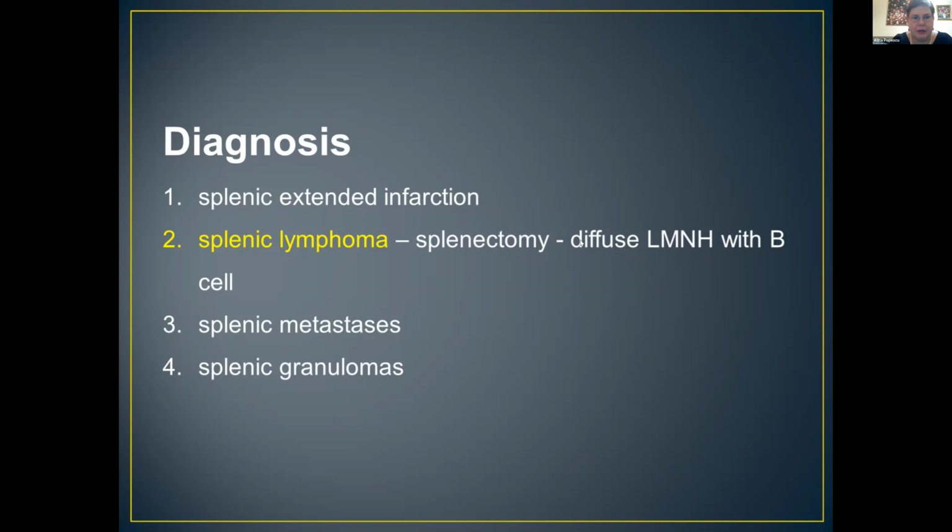Yes. I don't think that without taking down the spleen or a biopsy would have solved the case. So I think, again, that splenectomy was a correct answer. And I think mainly the role of CEUS was to tell probably it's a malignant lesion, and basing on probabilities, lymphoma.